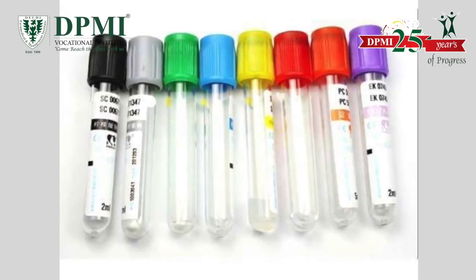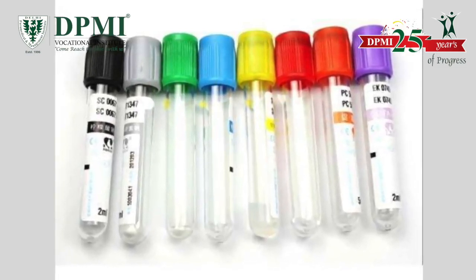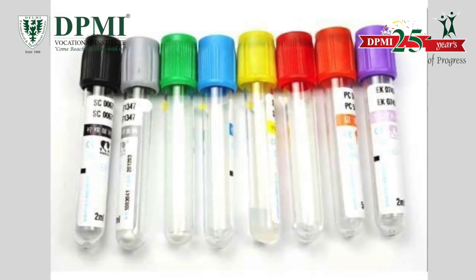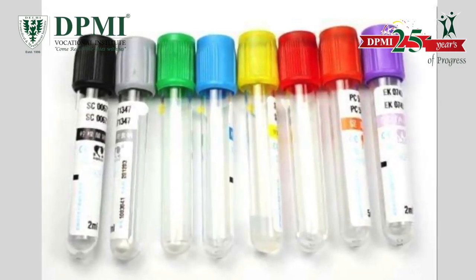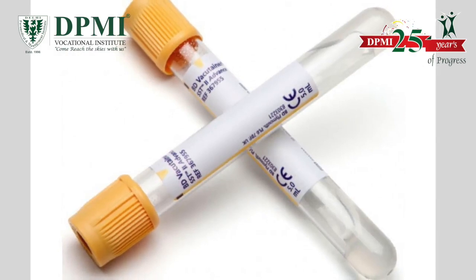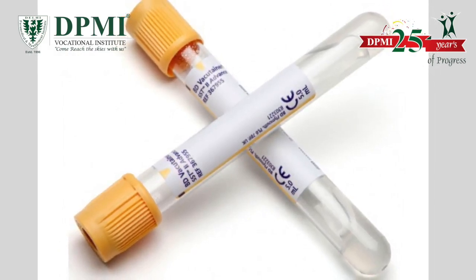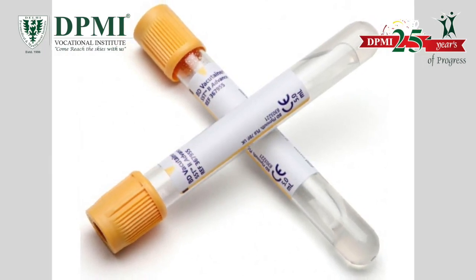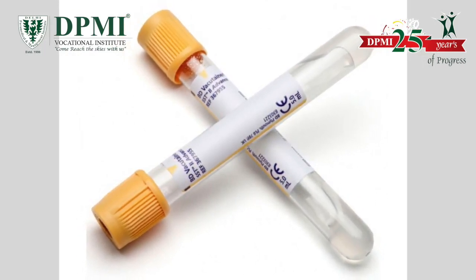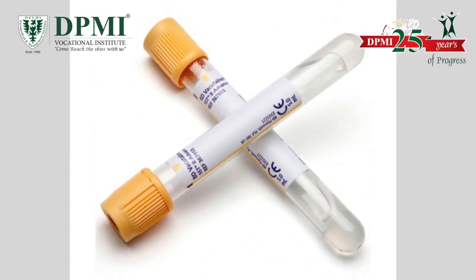VacuTainer tubes have a color-coded cap. The color code of the caps indicate the blood additives that the tube contains. Gold top SST tubes contain a gel separator and clot activator for serum separation. These tubes are used for serological and immunological determinations.